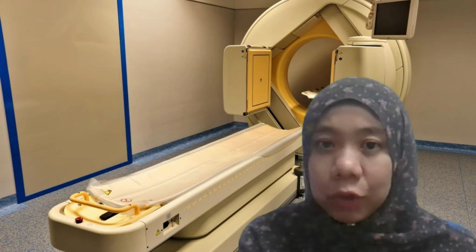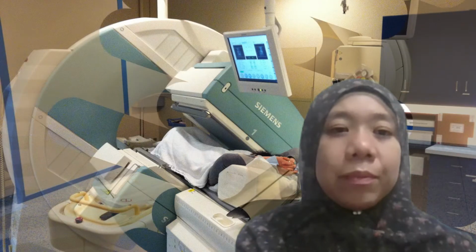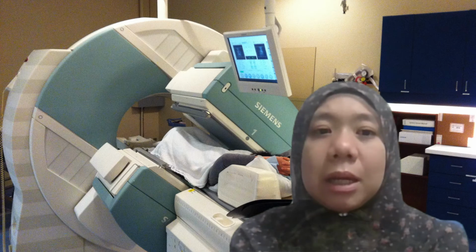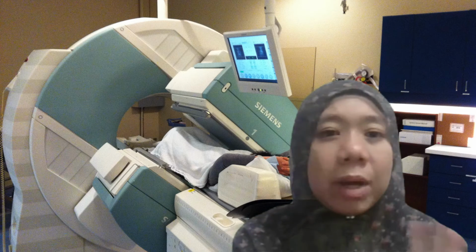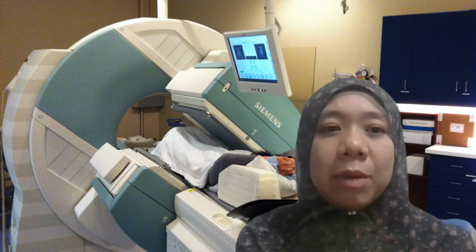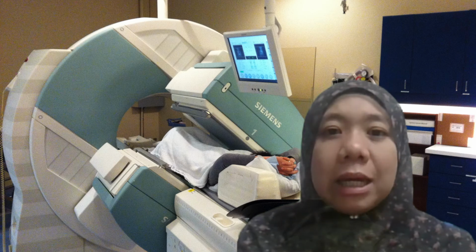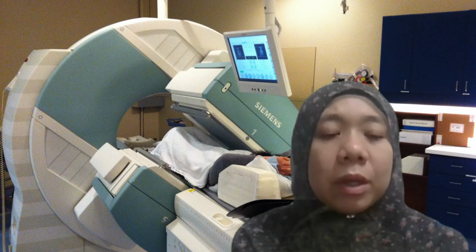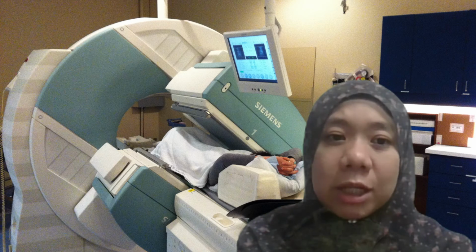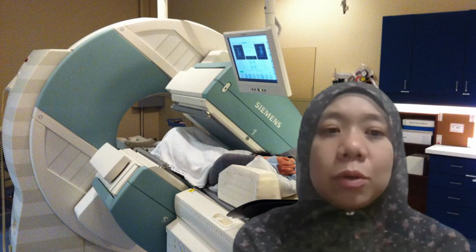In addition, nuclear medicine also differs from radiology, which just emphasizes imaging anatomy but not function. Therefore, in nuclear medicine imaging, we are emphasizing physiological imaging, and the modalities in nuclear medicine imaging include SPECT, PET-CT, and also the gamma camera.